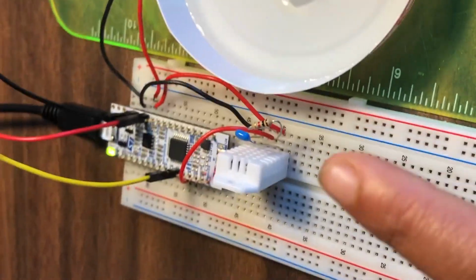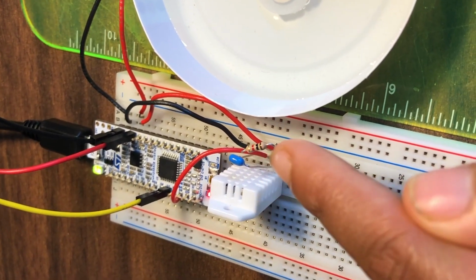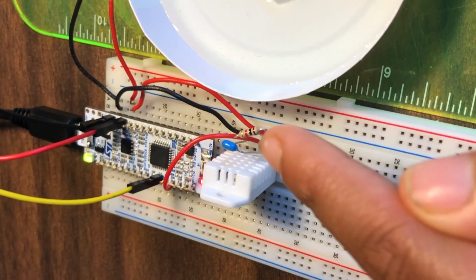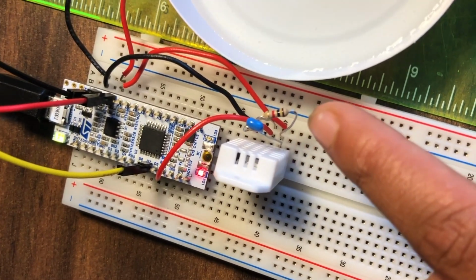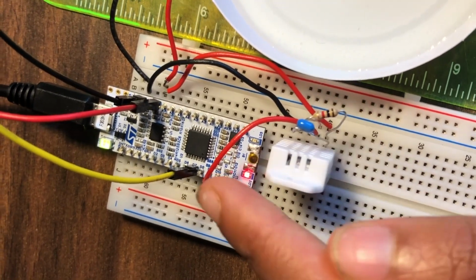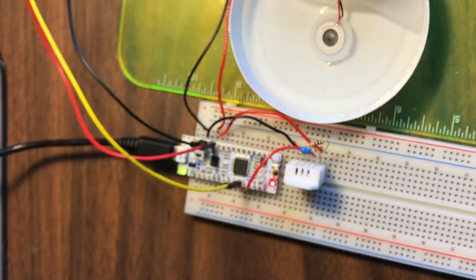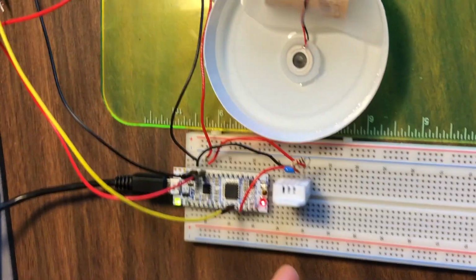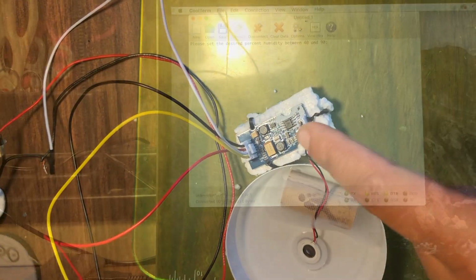The sensor has a 1K pull-up resistor and a 100 nanofarad capacitor for wave filtering. The second pin, pin 2, is connected to D8 of the microcontroller. This is the signal input, digital input. And the enable controller is connected to pin D7 here with this yellow cable connected to the driver board.